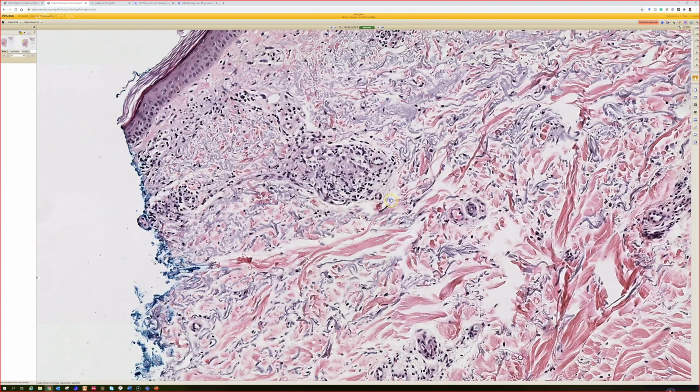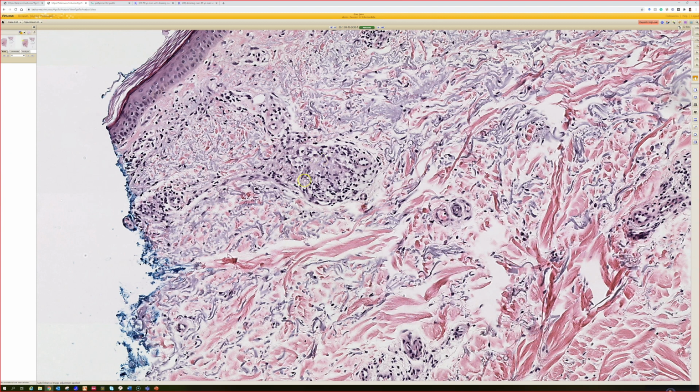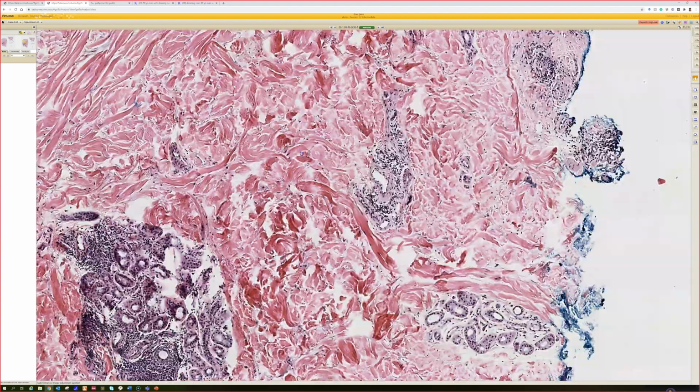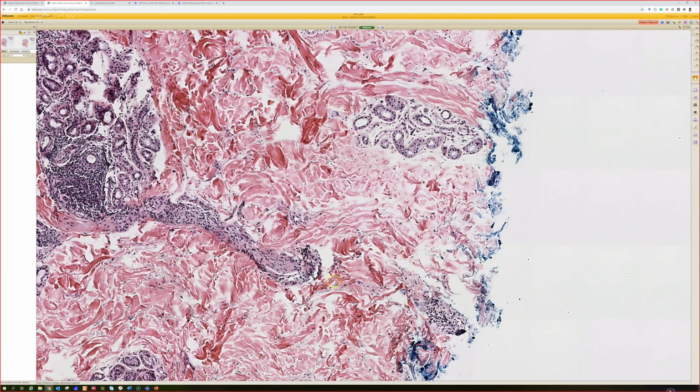We know that in leprosy, we tend to get granulomas around the nerves. Well, remember, nerves and vessels, even at the small level, track alongside one another. So anytime I see granulomas near a vessel, I suspect that there may be near a nerve as well, even if I can't really visualize the nerve itself. So that's one little clue to always think of.